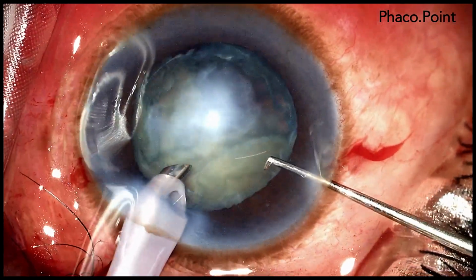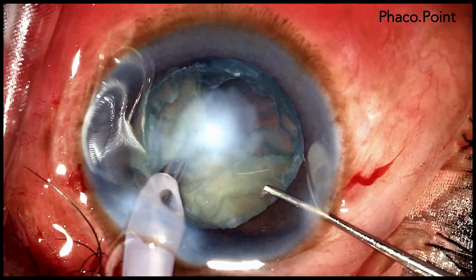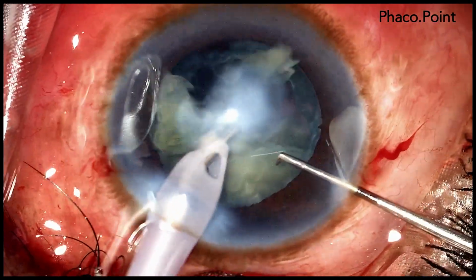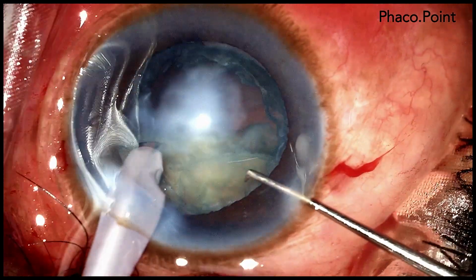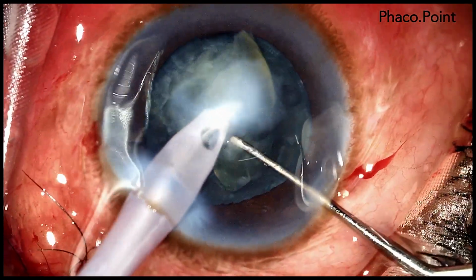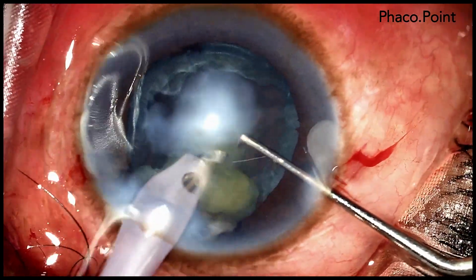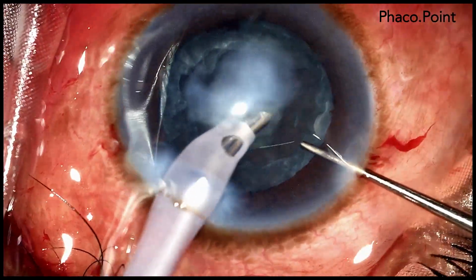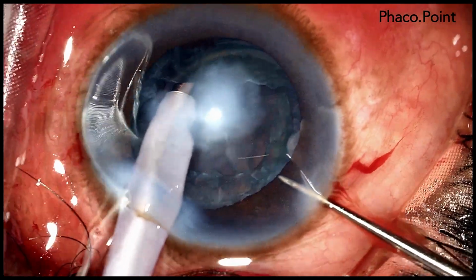In this way, each heminucleus is now elevated out of the bag and broken down into smaller fragments prior to the emulsification. This is what you will see in this part of the video. Note how I try and perform all my steps of nucleus disassembly and emulsification in the area of the clear cornea where I have much more visibility.